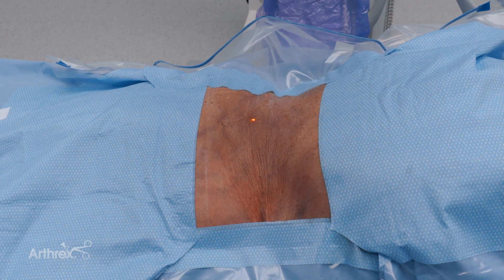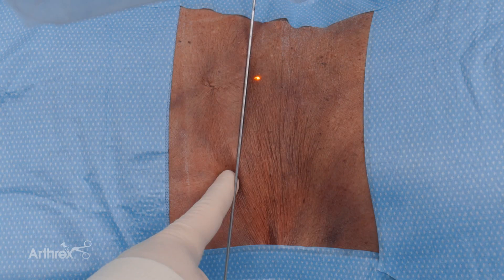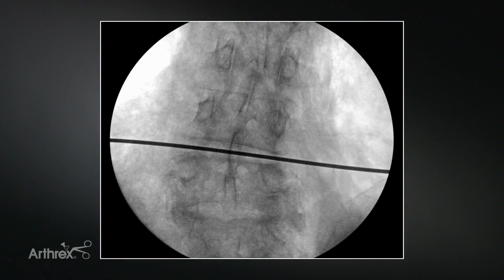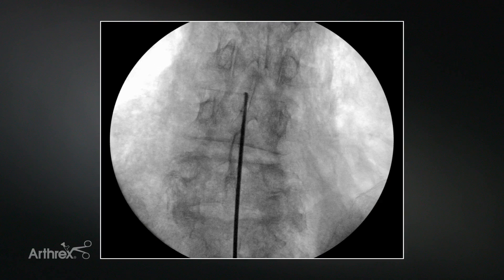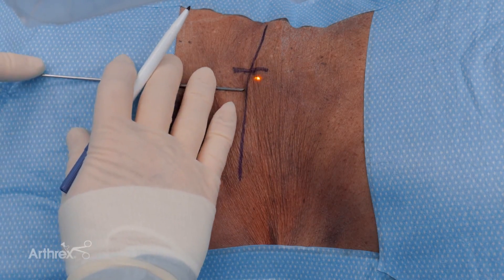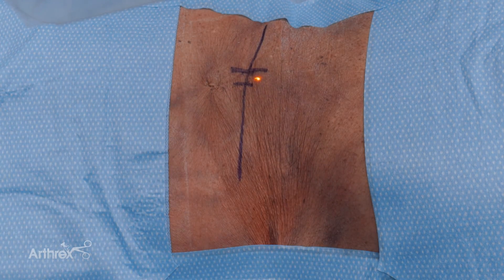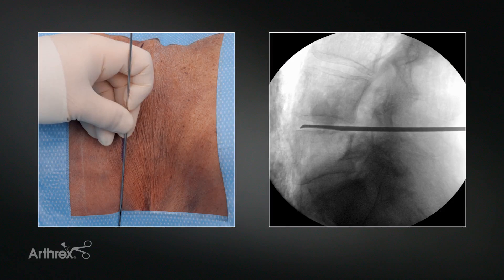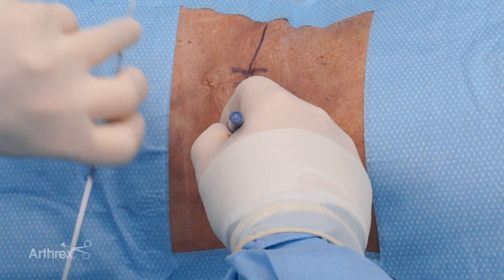First, get an orthogonal view of your intended disc space on both the AP and lateral view, which we've done on x-ray. Then draw lines identifying the center of the disc on both of those views — there's the center of our L4-5 disc and our midline. I like to mark the medial pedicular line, which gives me an idea of how deep into the spinal canal I am. The line to the center of the disc to the very anterior annulus — that depth from the midline marks our approach.